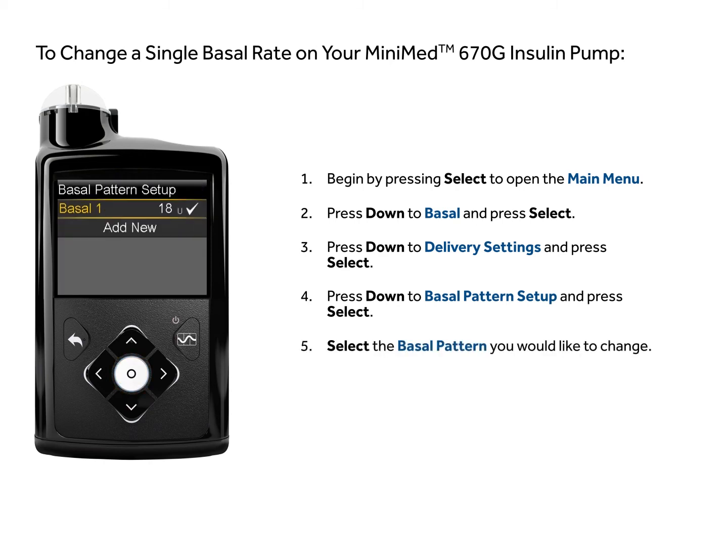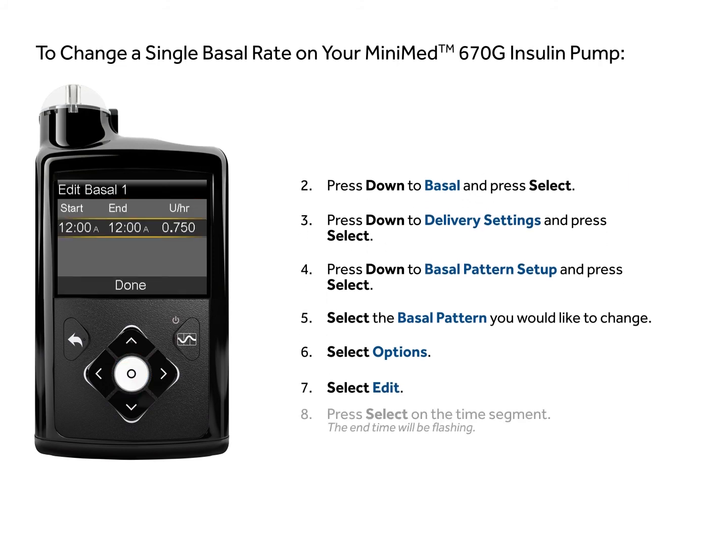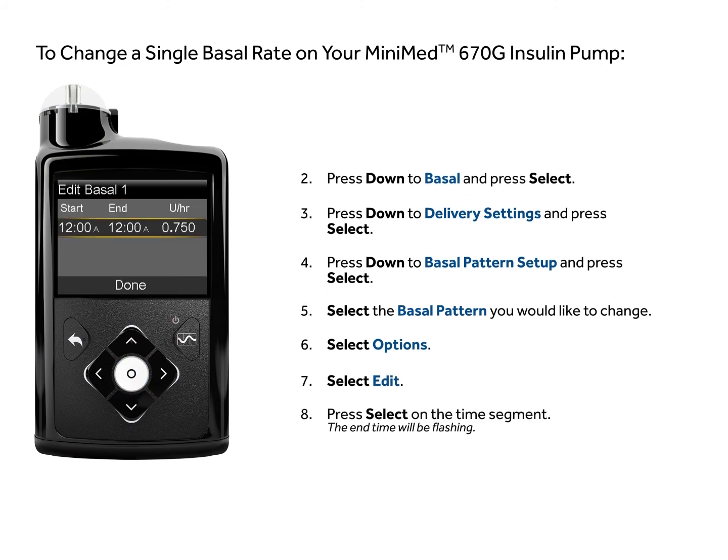Select the basal pattern you would like to change. Select options. Select edit. Press select on the time segment.